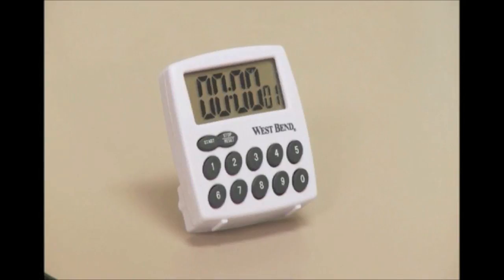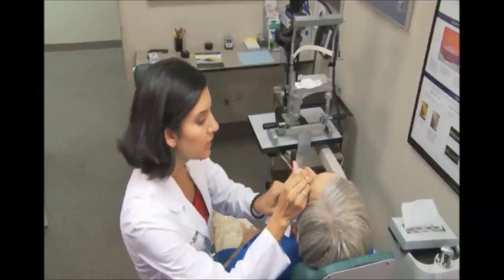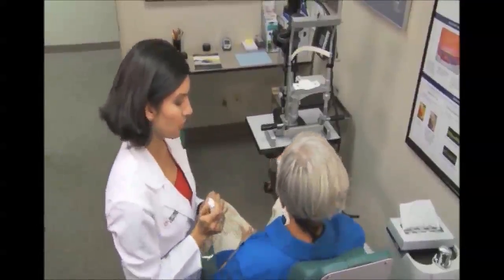15 minutes after the infusion started, the timer will chime an alert. Administer anesthetic eye drops to the affected eye prior to administering the photodynamic therapy. At this time, the laser treatment can begin.